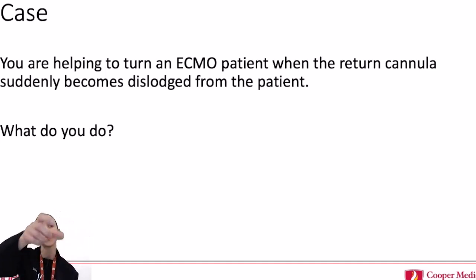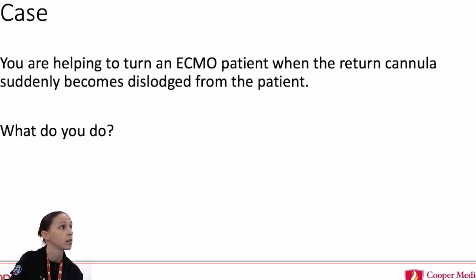So remember that you dial in RPMs, but you get the flow that the resistance allows, as Dr. Knoll says. So if your patient's dry or your patient's hemorrhaging, you may turn up your RPMs and not see an increase in flow. So why does turning down RPMs help these suction events? It releases the vessel. Exactly. So you're turning down the RPMs, you're kind of lowering that suction pressure, that negative pressure. Good.